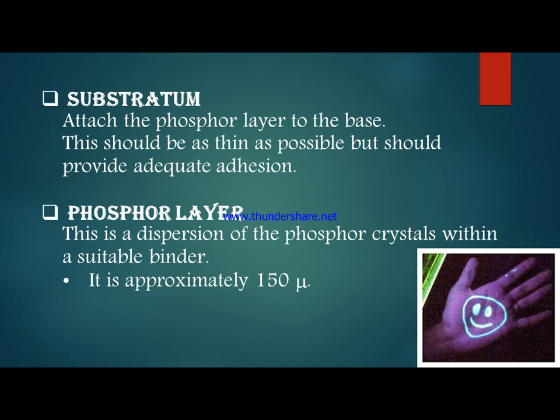Another layer is called the substratum layer. The substratum layer attaches the phosphor layer to the base, and it should be as thin as possible but should provide adequate adhesion. Next one is the phosphor layer.